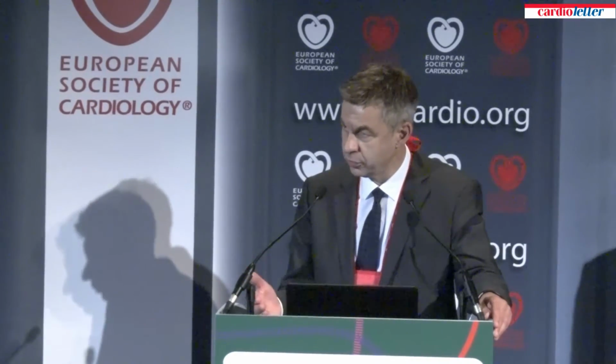Just very briefly, Shelley Wood with TCTMD again. Is an absolute difference in FFR of 0.02, can you tell me whether that's worth an increase in radiation and contrast dose? I mean, just trying to see the risk-benefit of such a small amount. Well, the OCT procedure required flushing the coronary artery with more contrast medium. That's why we observed such an increase in the volume of contrast medium in the OCT-guided group.